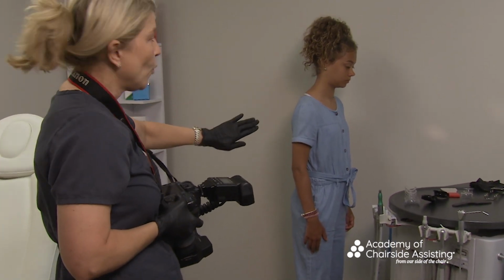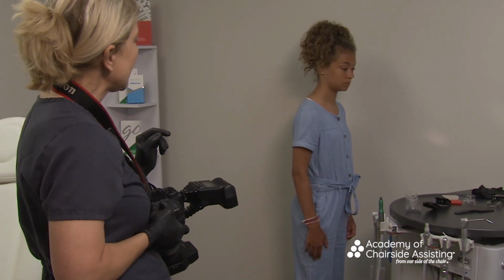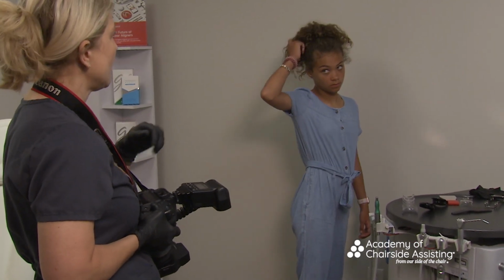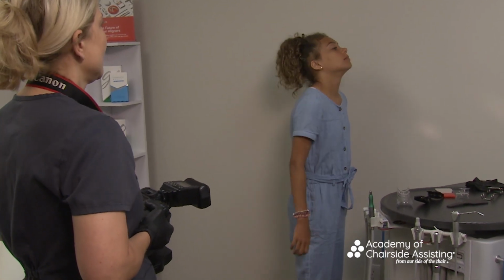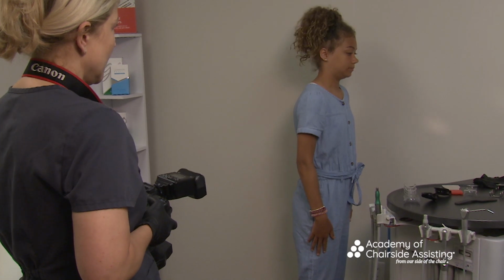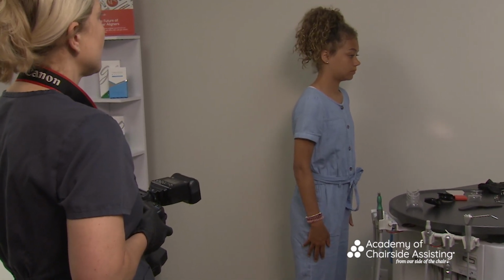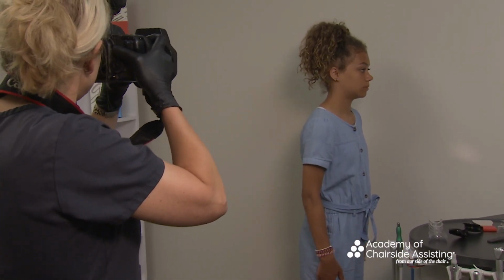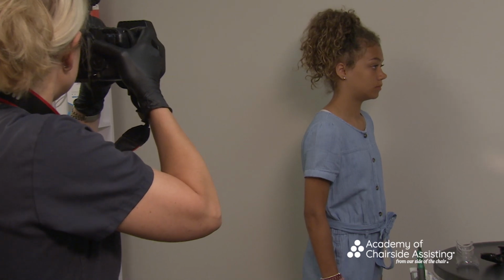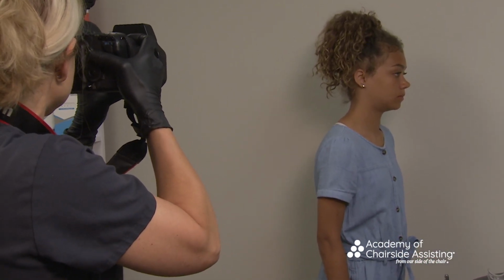We see this a lot. With a profile photo, that's not what's supposed to happen. So Kylie, I want you to take your hand and just kind of put your hair behind your ear. There we go. Just so I can see it. Perfect. Okay. So chin down. And if this is the way they are, I want you to raise your chin just a little bit. Keep coming, keep coming, keep coming. Right there. I'm going to move my body in and out. Remember, I'm not touching the dial. Move your body in and out, making sure you're really nice and focused.